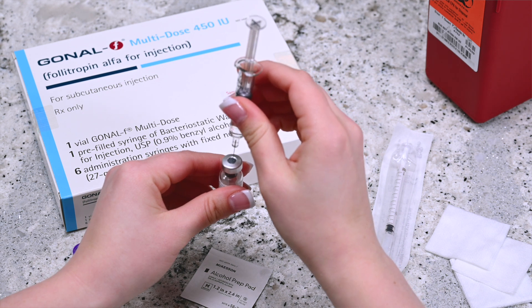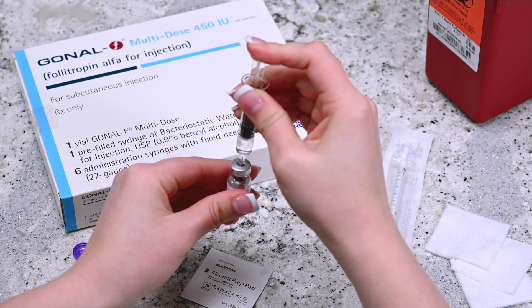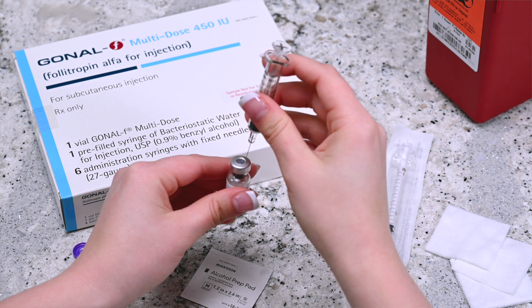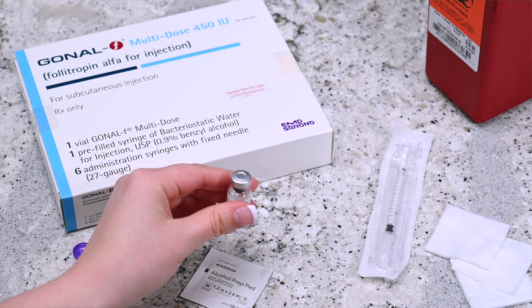Insert the needle into the Gonal F multi-dose vial and push the plunger until all of the water is inside the vial. Remove your finger from the plunger and carefully withdraw the syringe from the vial. Dispose of this used syringe into the sharps container.